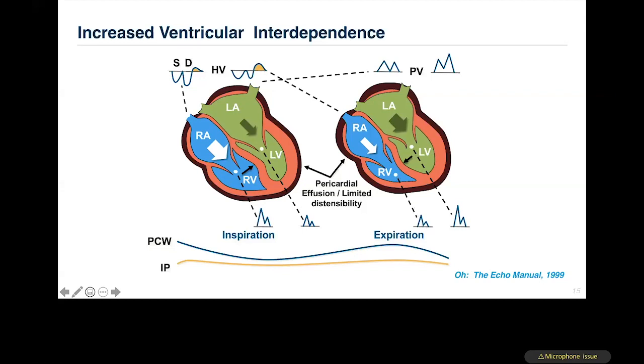And in addition, we see certain changes that are recognized in the hepatic vein and also in the superior vena cava that can be recorded using pulse wave Doppler. It's very important to recognize some of these features as well, particularly during the phase of inspiration, when the flow is coming inwards into the right ventricle. You will see a forward flowing velocity in the hepatic vein.